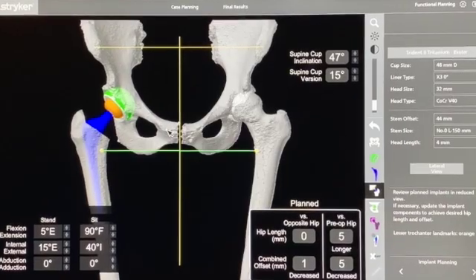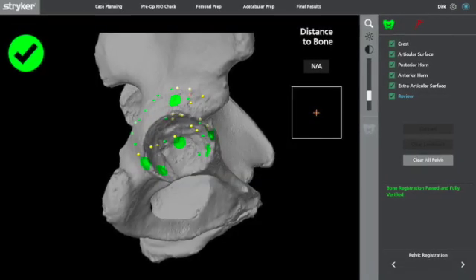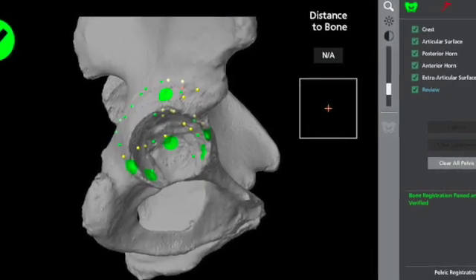Today I'm going to show you how you can use the Mako robot to implant a cemented acetabular component. Preoperative planning is carried out as if an uncemented acetabular component was being used. Acetabular bone registration and reaming is carried out as per a normal Trident cup.